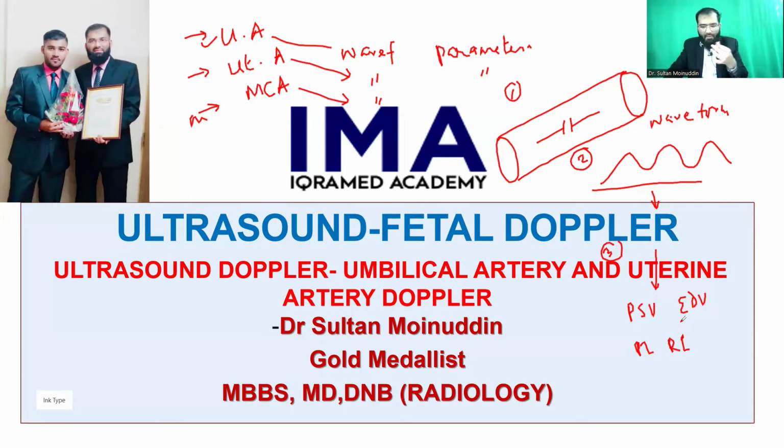Let's start with the very basics, and in between I'll be showing you videos of how the actual technique of examining these three vessels, that is the umbilical artery, the uterine artery and fetal MCA, is to be done. At the same time I'll also be discussing various important precautions that you have to take so that you do not get a false positive Doppler.